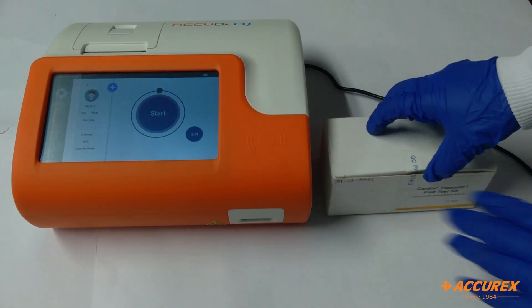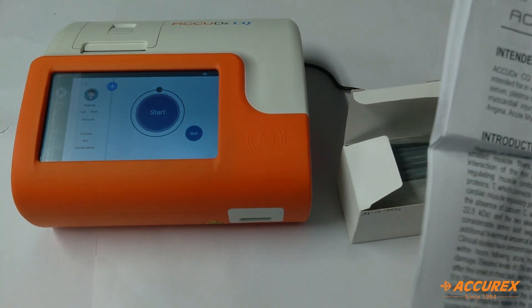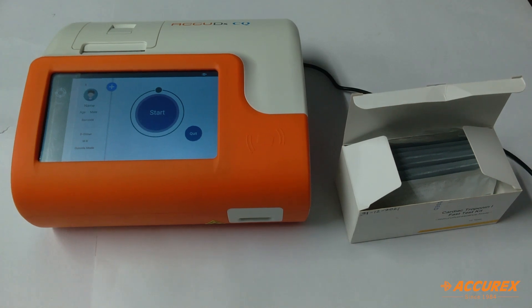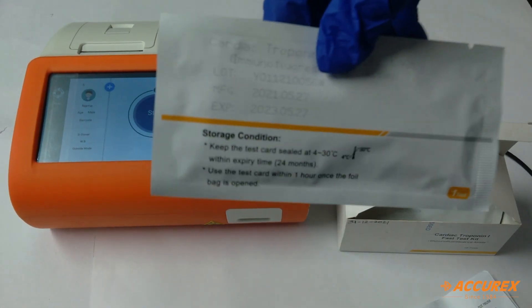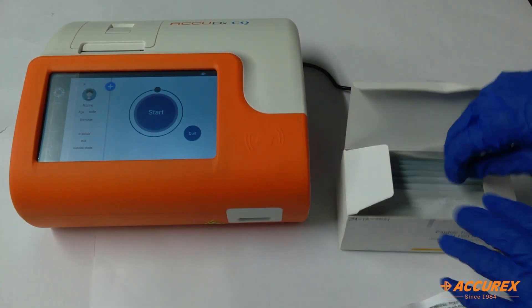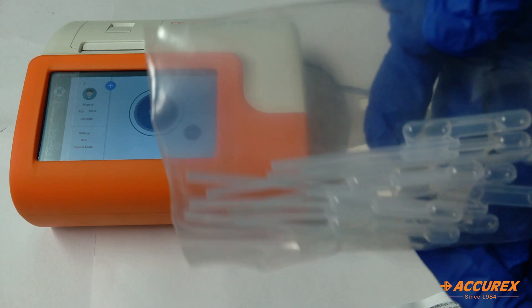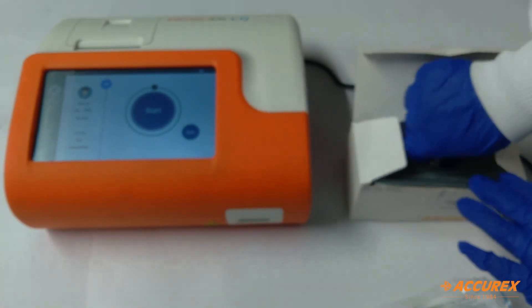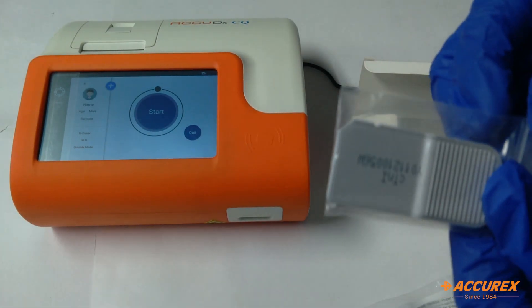First we'll see what all the contents are in this box. There is a pack insert in which all the process is given. Here is the test strip, these are disposable micropipettes, and this is the SD card.